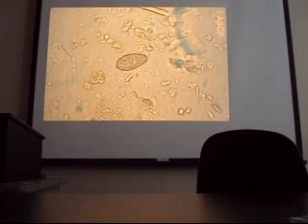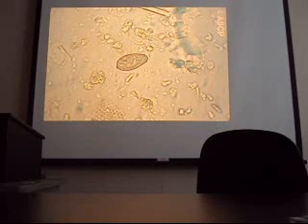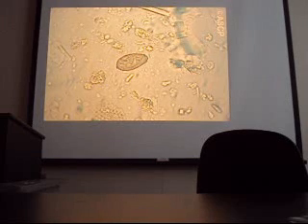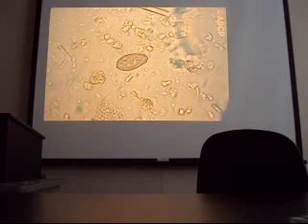Clonorchis or Opisthorchis sinensis, Chinese liver fluke. How will I ID this? Very small. What else? Shoulders. And on top of the shoulders is the operculum. You may not see the little comma-like knob at the abopercular end, because that's usually not what you see. How are you doing on this? Okay?